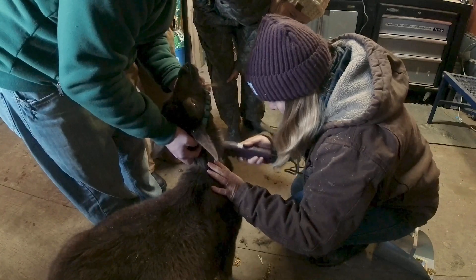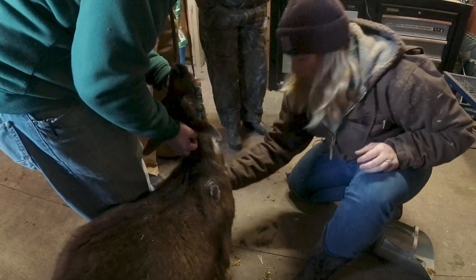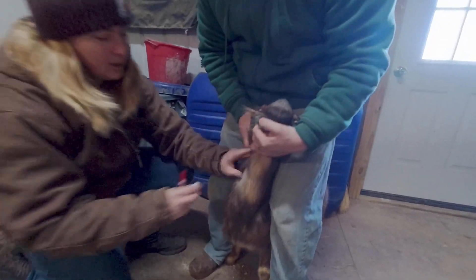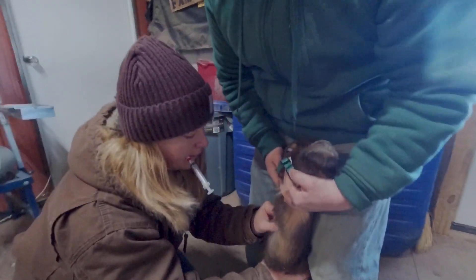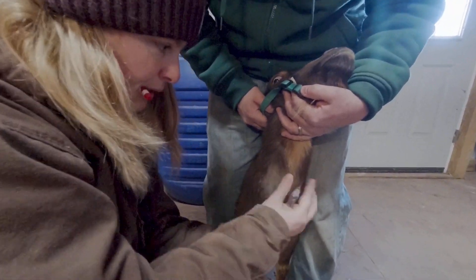If you're new at pulling blood from a goat, you may need to get your clippers out to clip the area — this lets you actually see the jugular vein and guides your needle in, making the whole process easier. Once you've clipped the area, swab it with rubbing alcohol. To locate the jugular vein, apply pressure right where the neck meets the chest and shoulders — it almost comes down into a perfect V. When you hold pressure there, the jugular vein will balloon up. If you're having trouble, go to the corner of the jaw and follow it down — the jugular vein runs right alongside the windpipe on both sides of the neck.